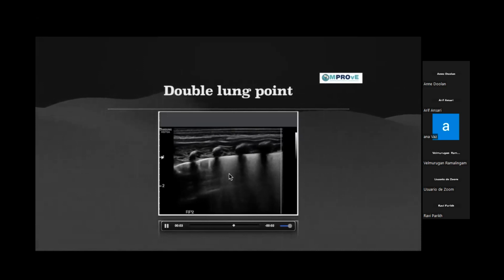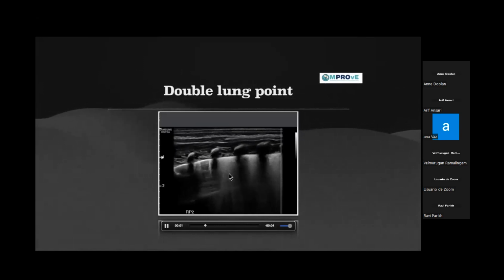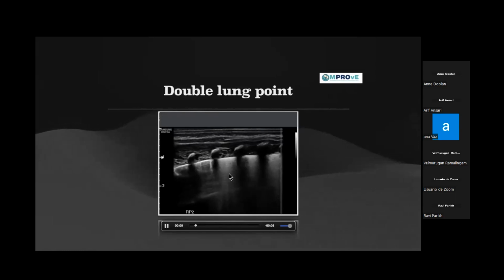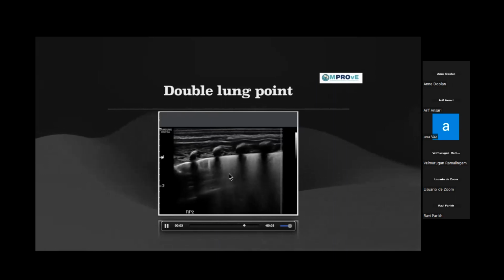When you have a global surfactant deficiency, why would you have a part of the lung which is well aerated and a part which is dense? Logically or pathologically, it can only be explained by TTN. A part of the area has more fluid than the well aerated part of that lung. So it indicates more towards TTN. Right. Moving on.